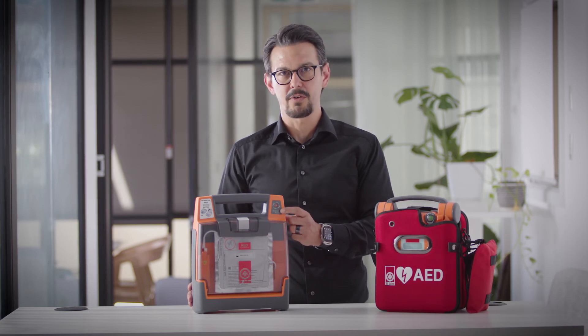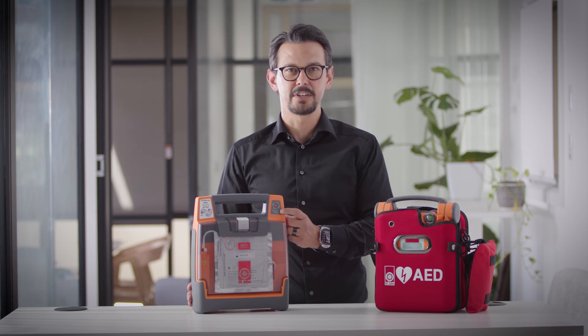If after changing your battery your defibrillator is still beeping and your rescue ready is red with a black cross, please contact St. John Ambulance.